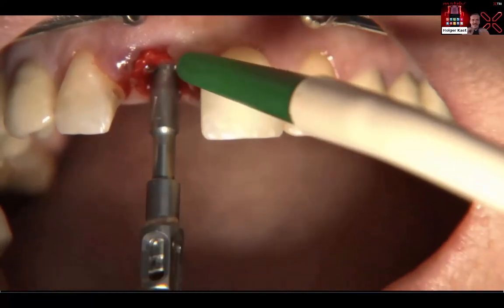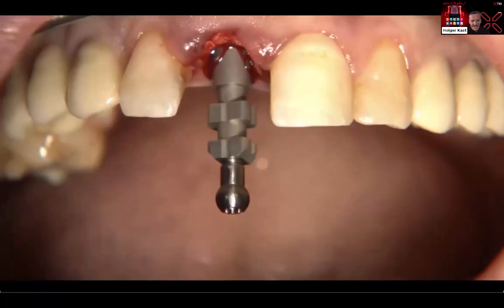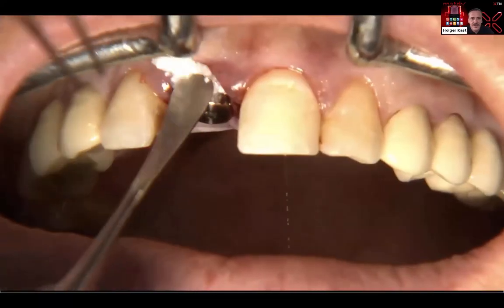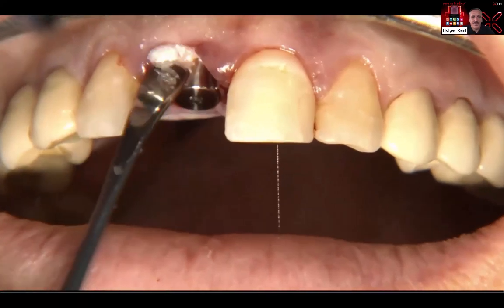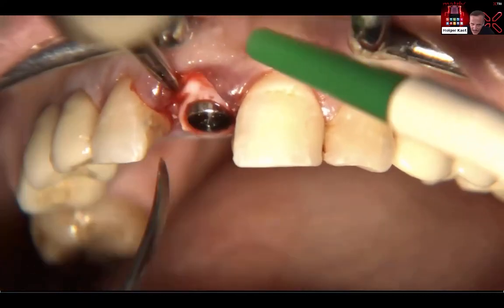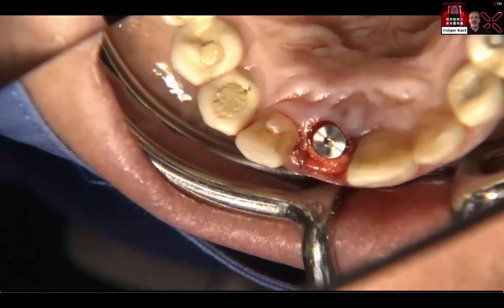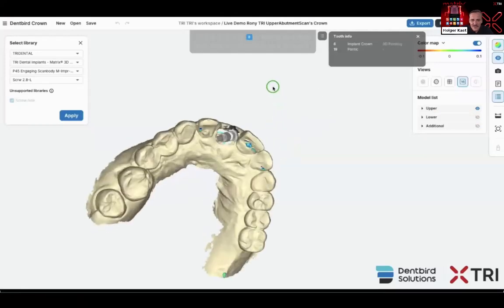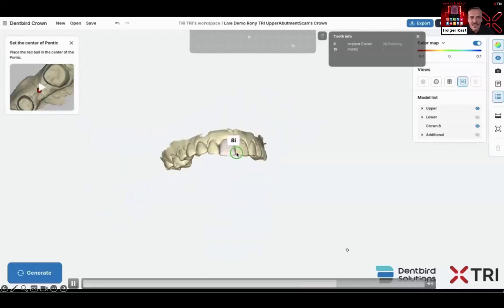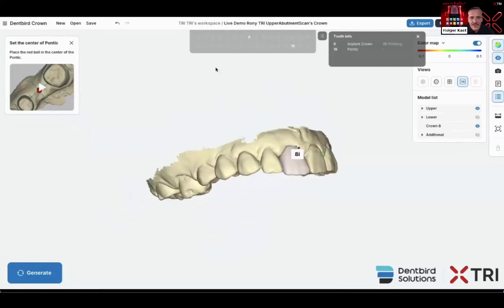And then you can add the scan body, and in the time the scan is done, the doctor is able to do some bone grafting, as you can see here now in this video. And now the 3D printer is already running, and after the crown is printed, you can place this crown, and this will come in a few seconds in this video. You can place the crown. And so there's also the design. I jump here a little bit quicker because Andrew will show that. So this is the STL file done by this AI software. And then you can place the crown in the patient's mouth.